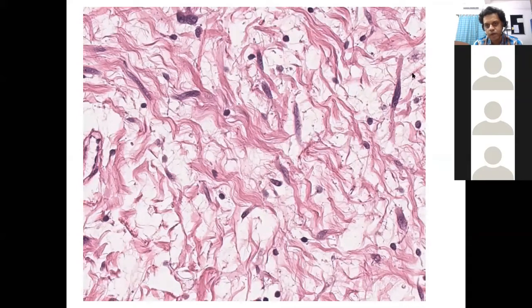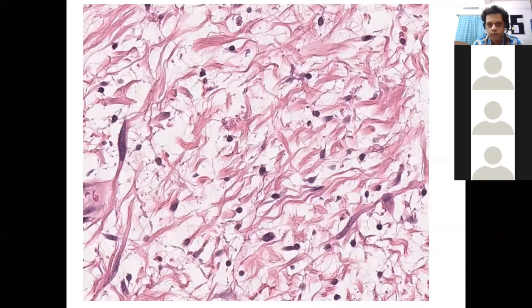Okay, so this kind of wiry, shredded carrot kind of collagen with this kind of Schwannian cells with a bit of fibrillarity to their cytoplasm. That's all that you will get to see in the case of a conventional neurofibroma. These are usually superficial conventional neurofibromas. That's what we expect. So nothing very serious about this, except that it's just to keep in mind that it's well circumscribed, it's paucicellular. There's a characteristic type of a collagen.